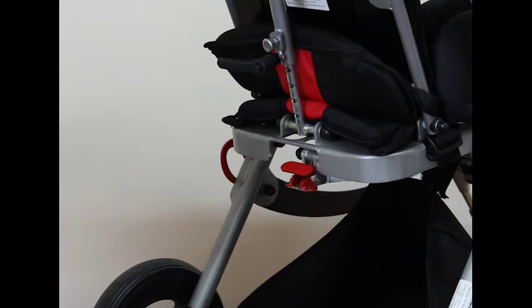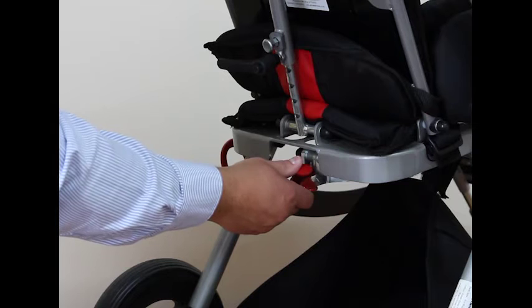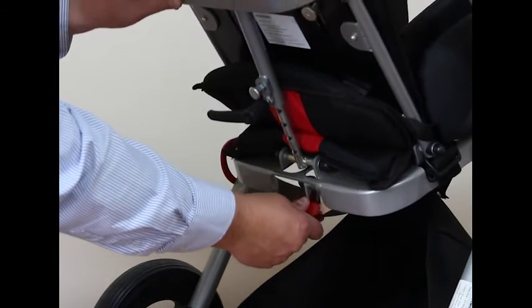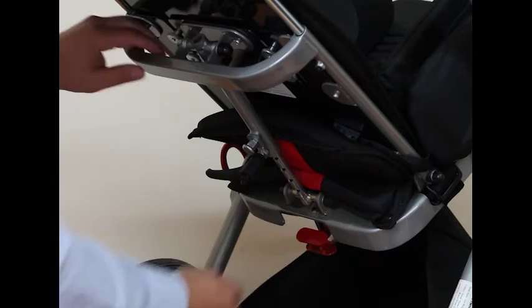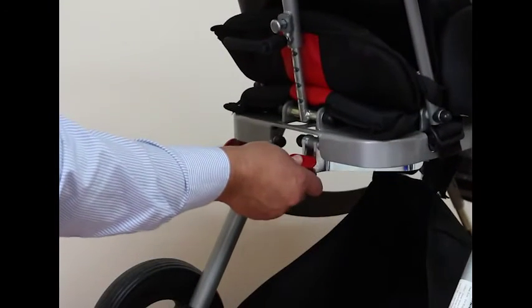The tilt in space mechanism is found at the base of the seat. Press this red button down to release the gas strut, then move back to the tilt position you require. To return, press the button again and bring it back into the upright position.